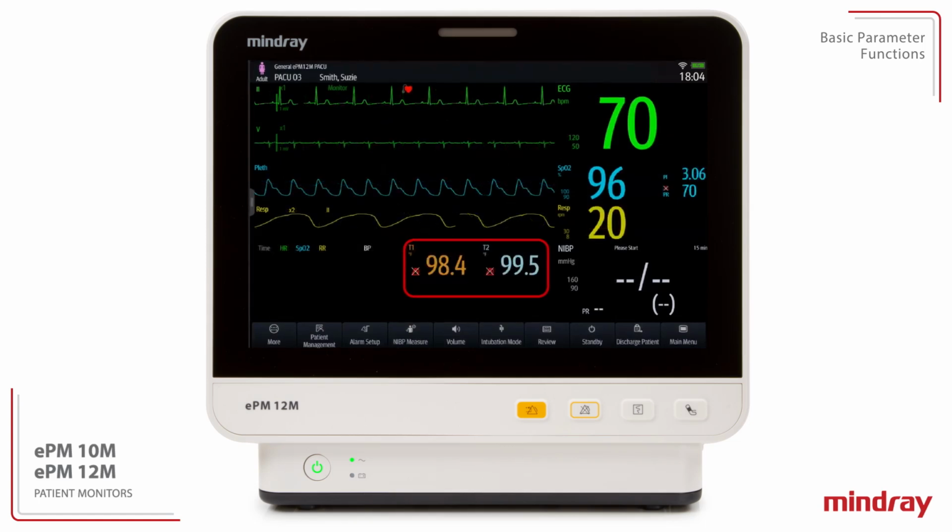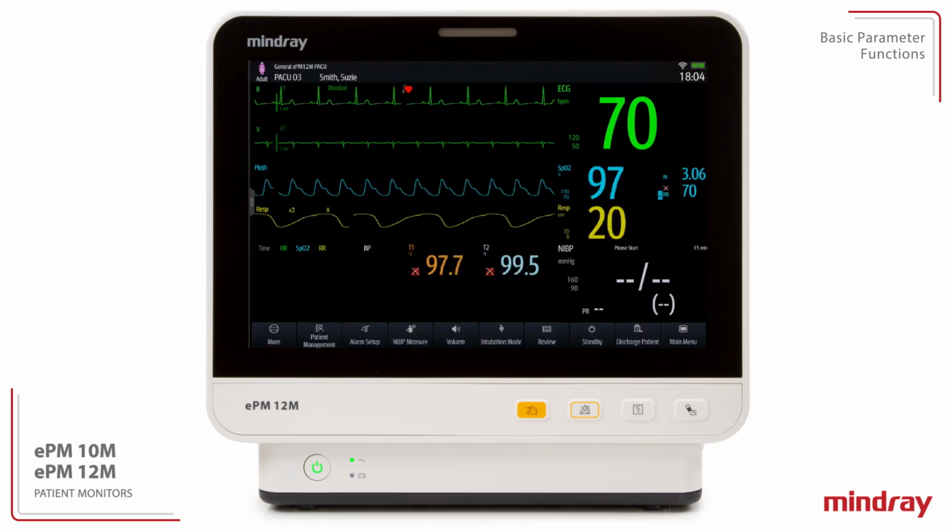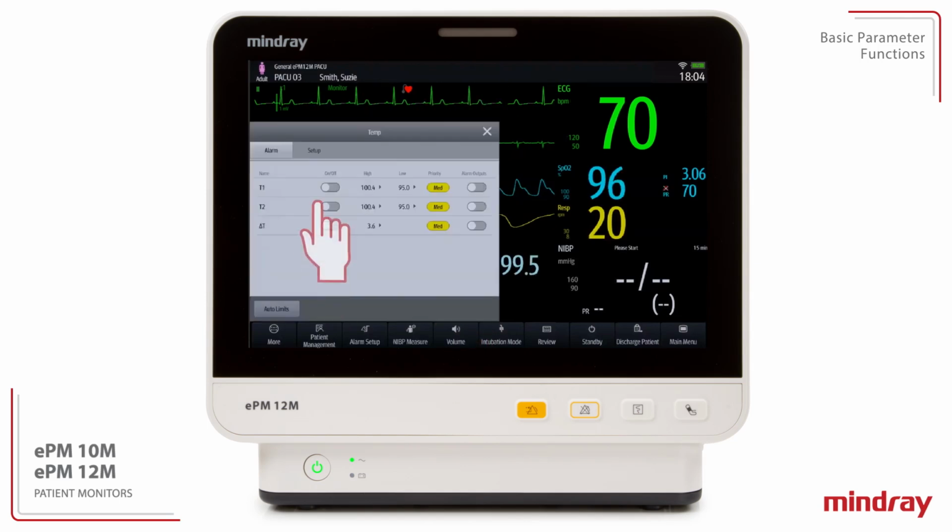Temperature is displayed in the numeric area when the temperature cable and probe are connected to the patient. Select the temperature numeric area to enter the temperature dialog to review or adjust the temperature alarms and labels.